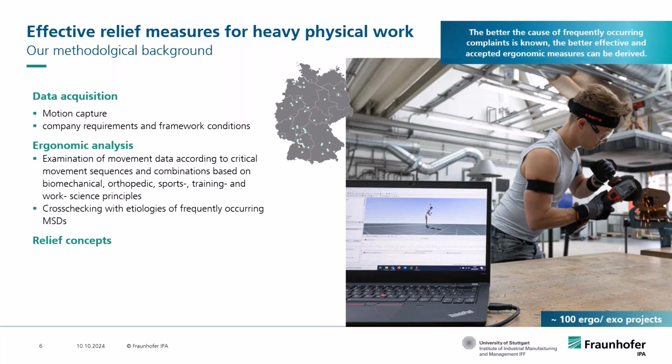A list of summarized posture times will not be able to see the difference between having a break or not, between leaning forward and lifting the battery. And when we say a pause, I don't mean doing nothing.